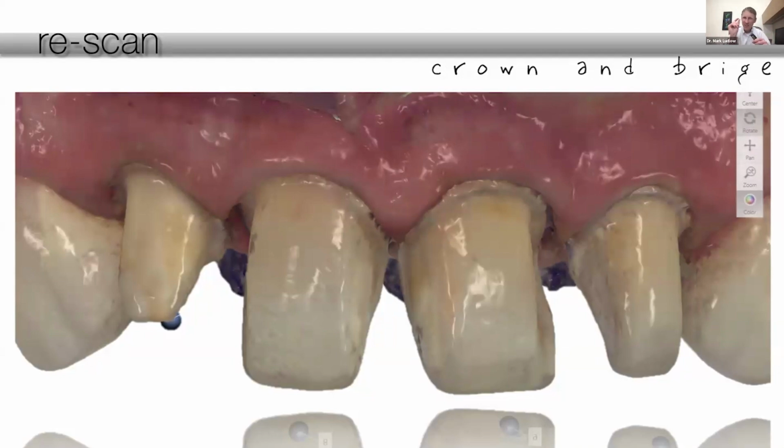That way you've only got to scan that one little thing versus having to take a full other impression of the patient. The other thing this does for you is really interesting. I still remember this when I got my first scanner, because your preps go from being this big to blown up 8 million times on the screen.